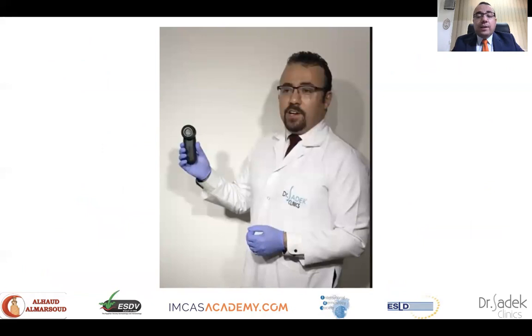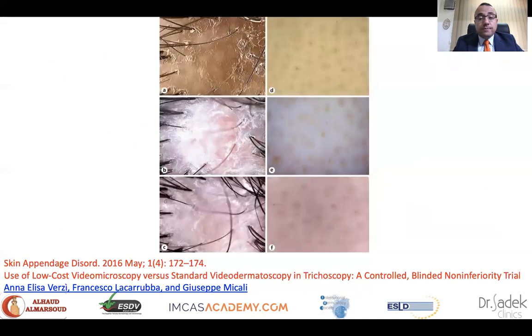We are going to mimic that you are sitting with me in a hospital setting or in a clinic setting, and I'm going to tell you exactly what I do with each single case and try to answer your questions in order to maximize your experience out of this workshop. But first, I have to tell you that there is a big difference between a dermatoscope and a folliscope. On the left, you can see the images of a folliscope or a USB attached microscope to your laptops. And on the right, you can see the image by dermatoscope, and you can see quite a big difference in the assessment and the appreciation of the follicular ostia.